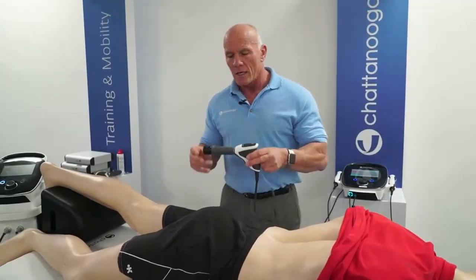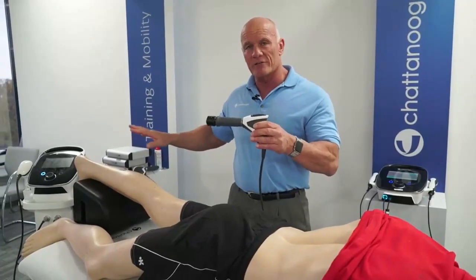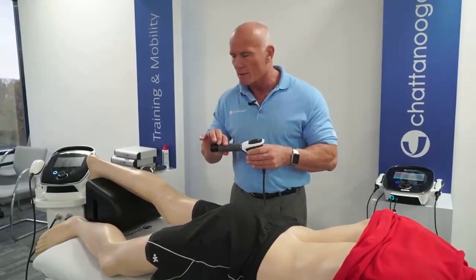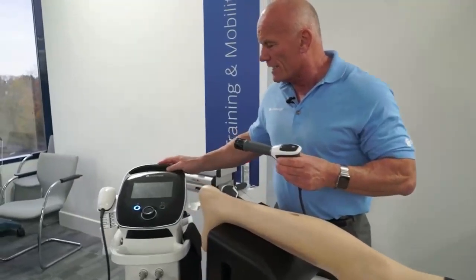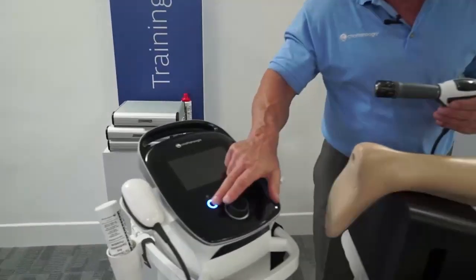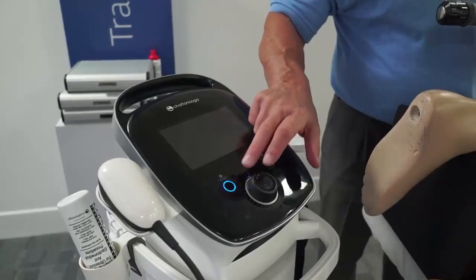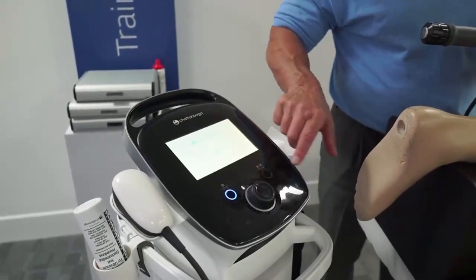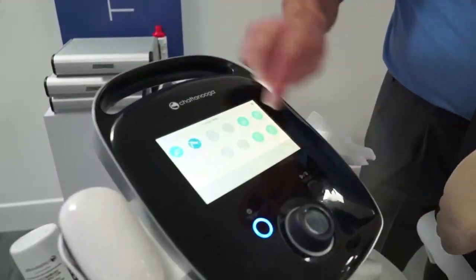And what we do, we use a low frequency, 4 to 6 hertz. Generally I use 4 hertz, that's 4 impulses per second. And if I just turn the machine on here, I'll let you hear what that actually sounds like. Boot up. Okay, so I choose radial pressure wave.